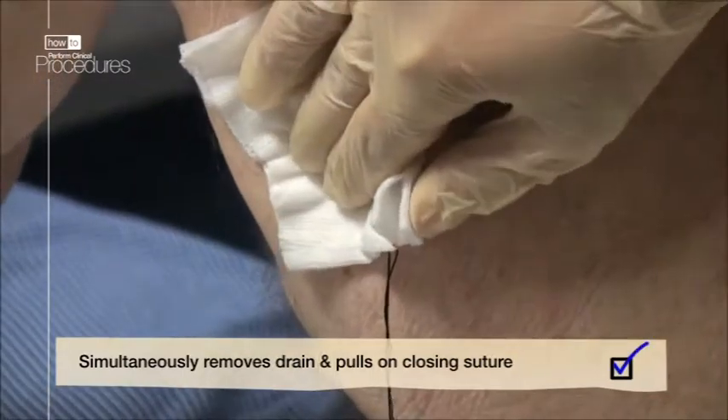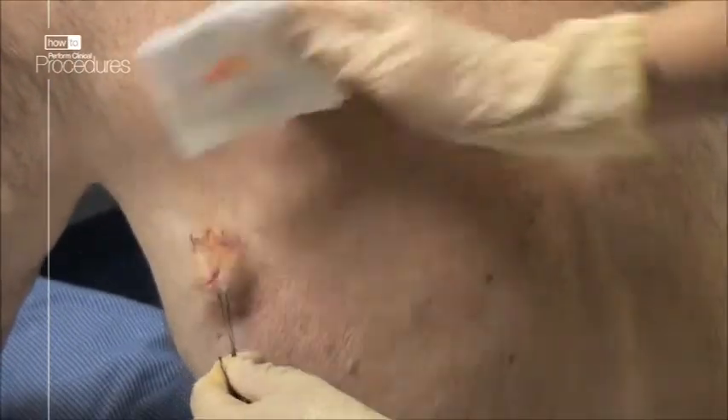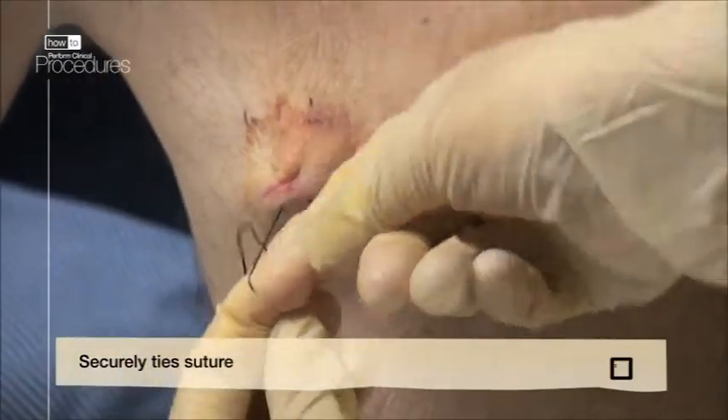Quickly remove the drain, cover with the dressing, and pull tight the two free ends of the suture to close the drain site. Remember to tie the suture securely.